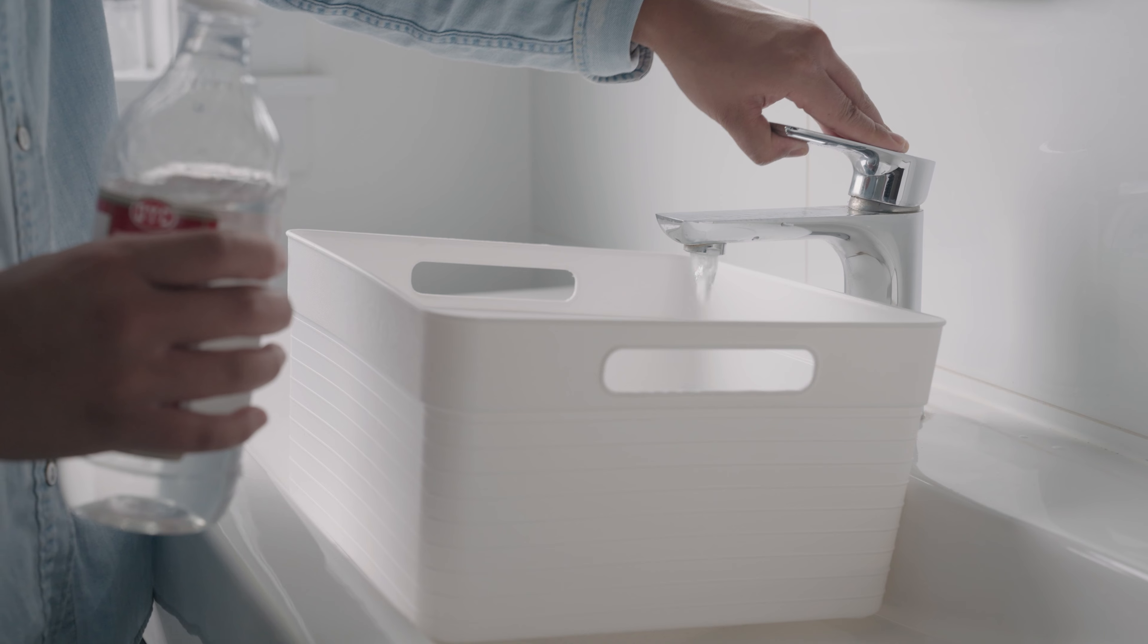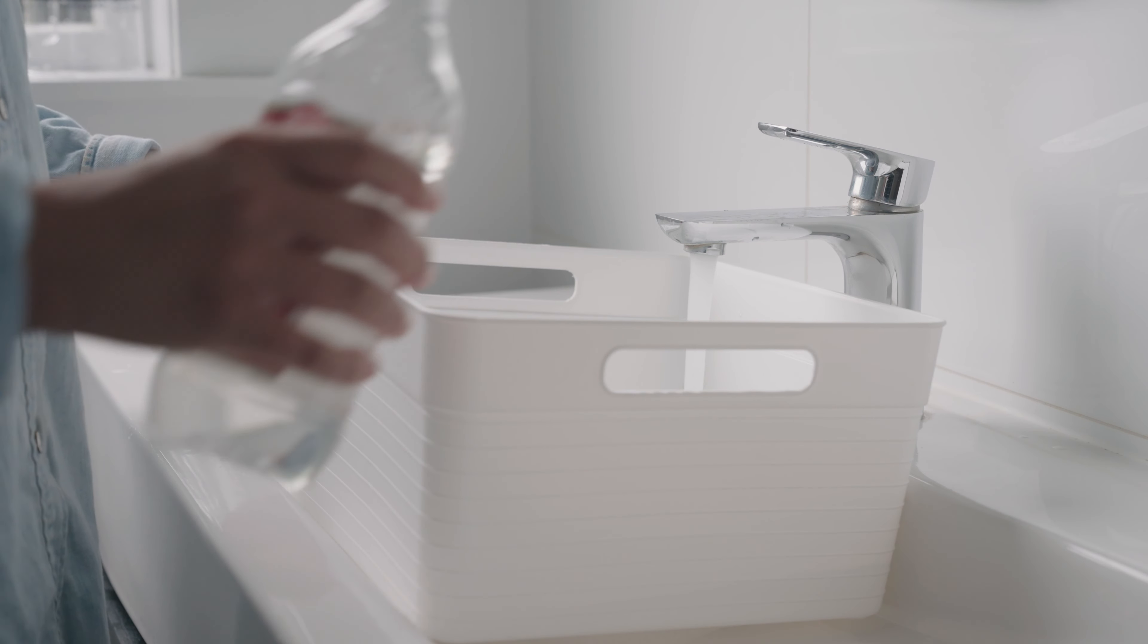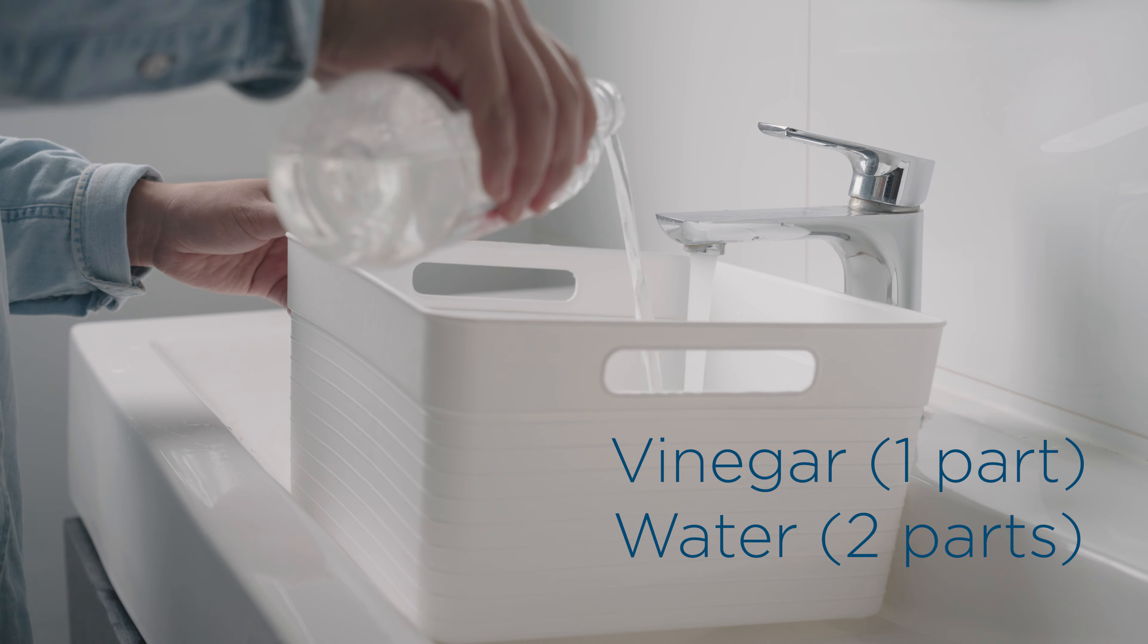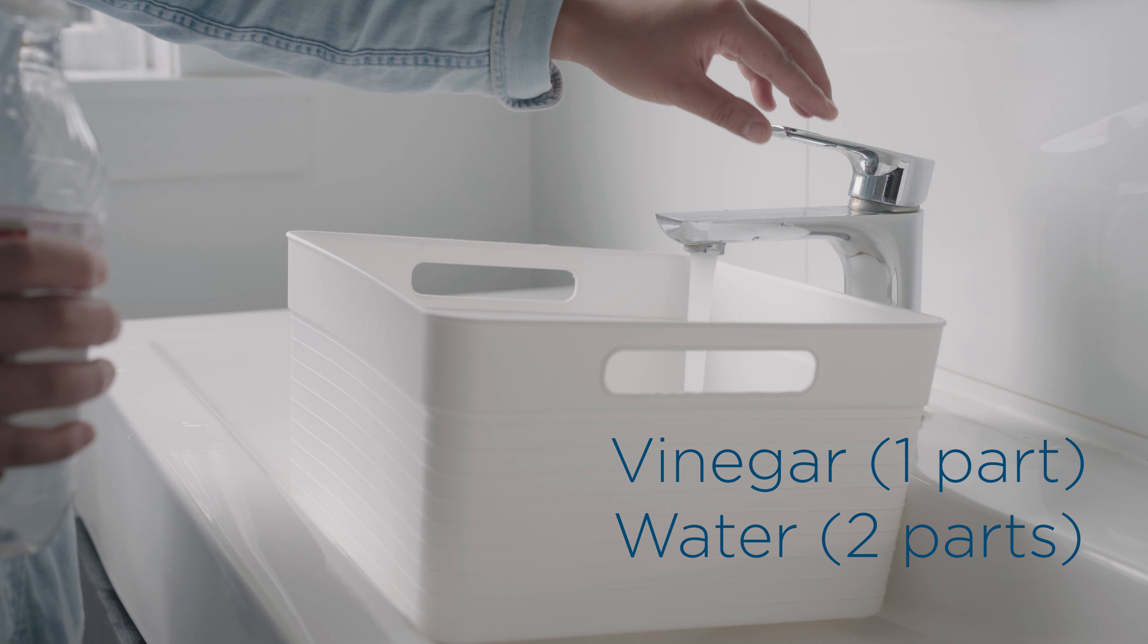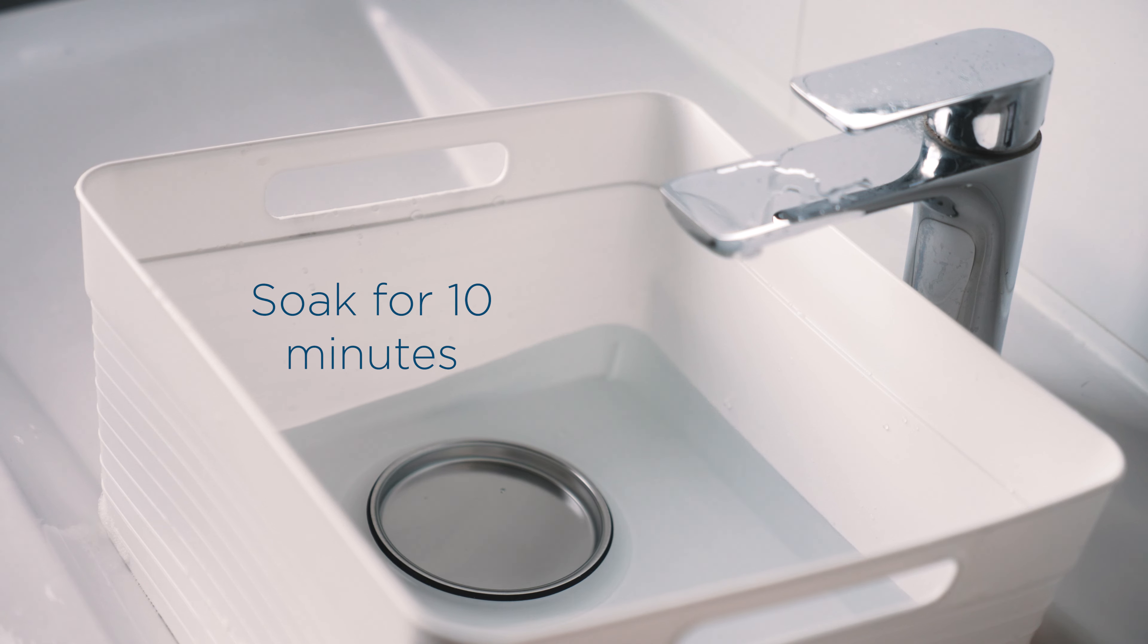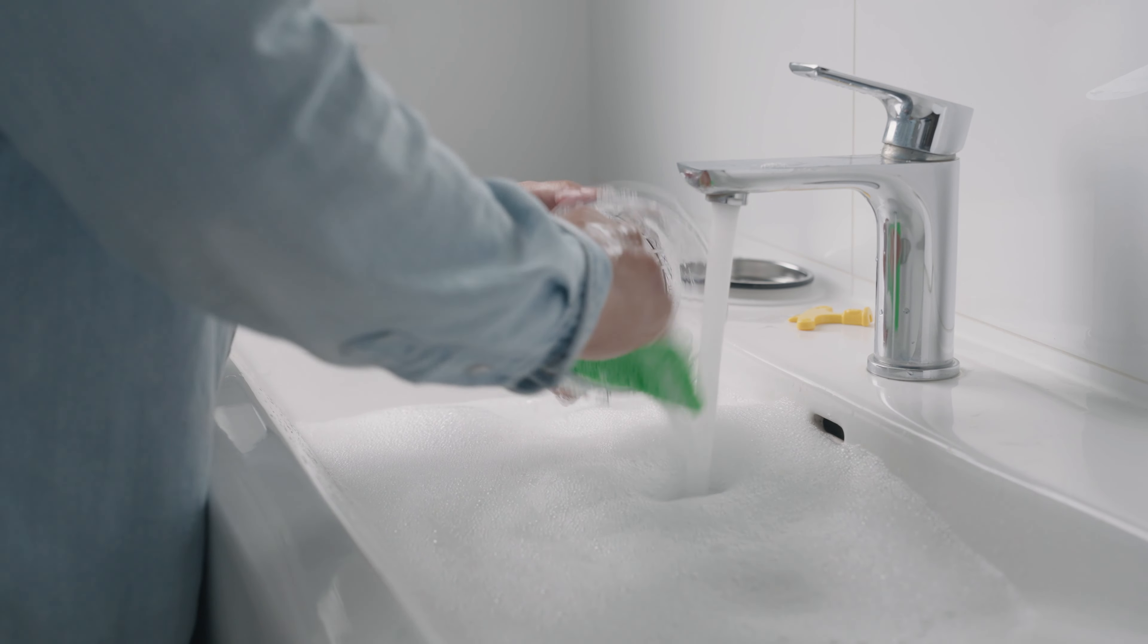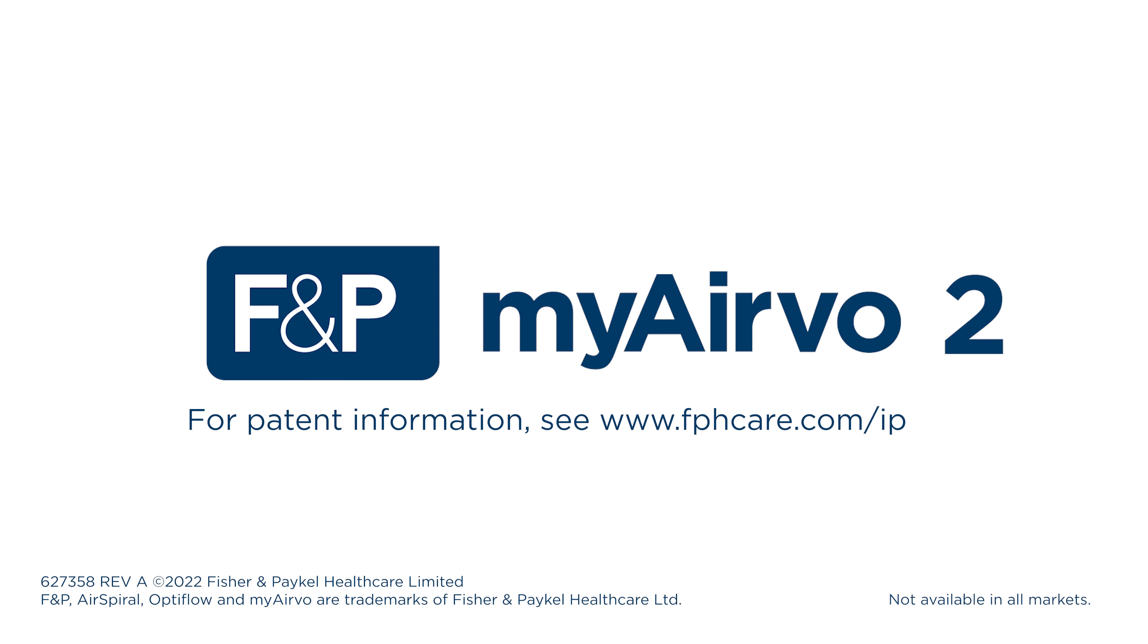Your chamber may discolour over time due to mineral deposits found in tap water. To reduce this build-up, soak the base in a solution of one part vinegar and two parts water for 10 minutes. Clean the chamber dome by following daily cleaning steps prior to next use.